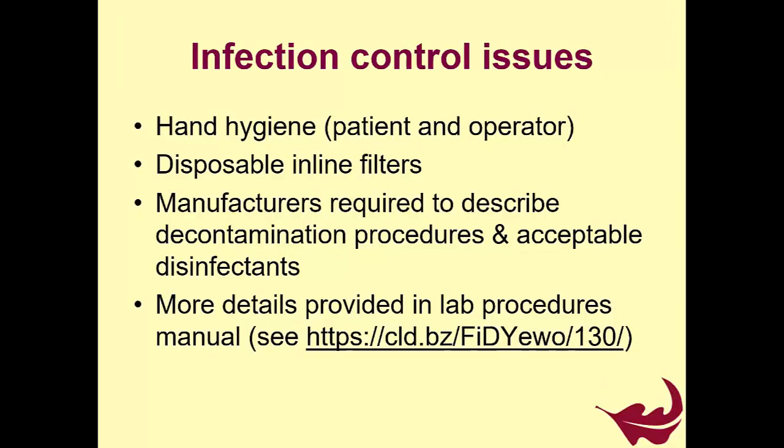Of course, there's the reference to COVID, and that's not the main thrust of this talk. I'll just briefly refer to this, and I've got a few slides at the end, if we've got time, where I can talk to some of the concerns regarding spirometry during the COVID period. But in terms of infection control issues, obviously one would look at hand hygiene for the patient and the operator, and using disposable inline filters.